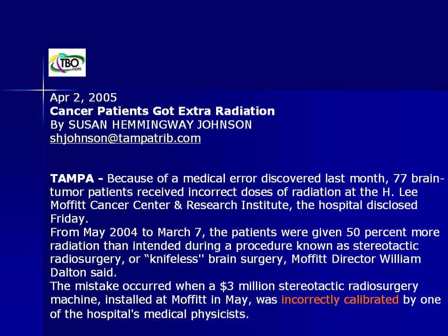So when you say redundant checks, how often? Well, especially a brand new machine, maybe you want to get some independent TLDs sent in. And this is a smaller place, maybe with some new staff. So bringing in TLDs, for instance, or have a second person come in and double check their calculation, or start from the beginning and do it by hand and figure out why aren't these two numbers matching. I would have at least done those type of things.